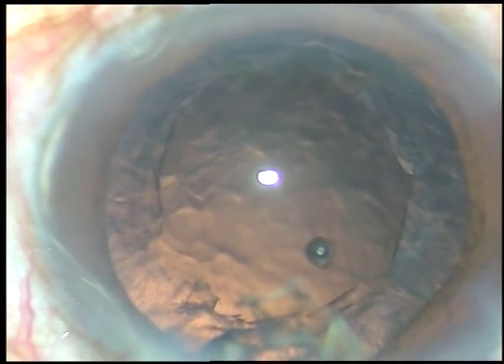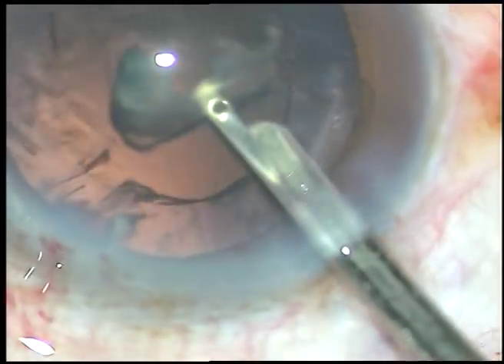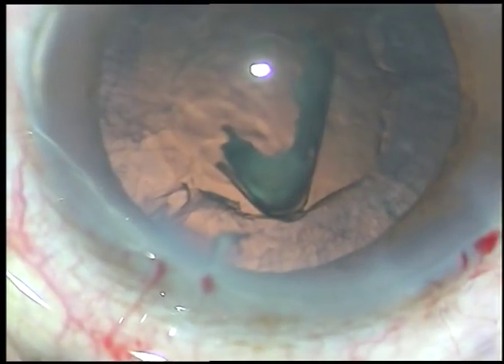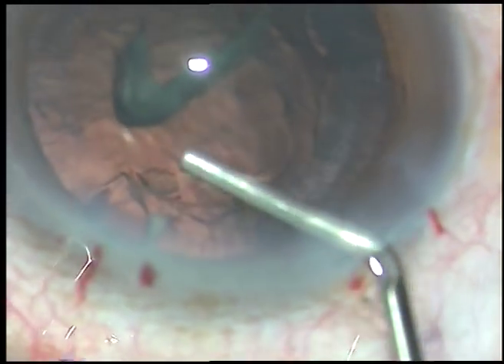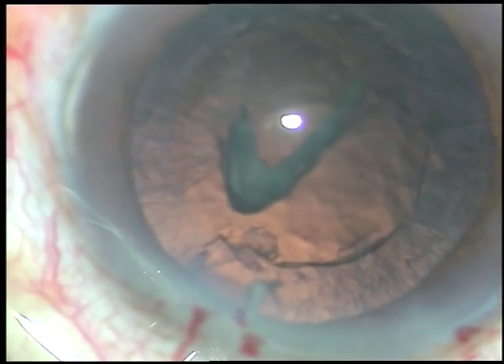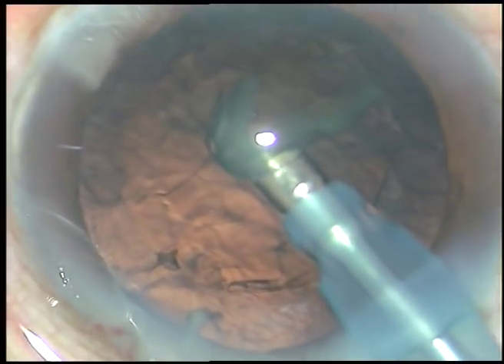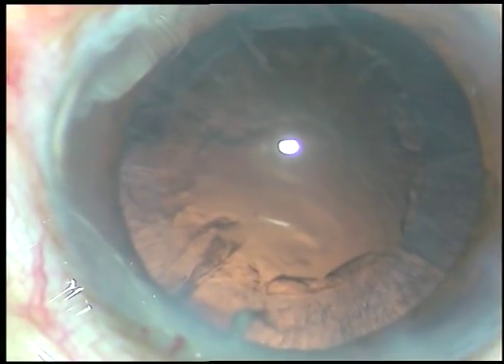In this case a bit of nucleus or epinucleus is still there. Let us see if we can remove it through the main incision. It is quite a large segment and not likely to come out through the main incision, so visco is injected around this epinucleus — it is trapped in the viscoelastic substance in the anterior chamber, and with just one burst of ultrasonic energy it is removed.